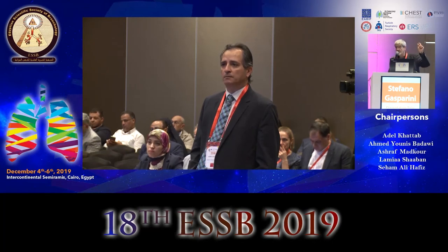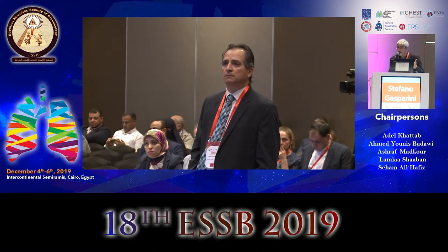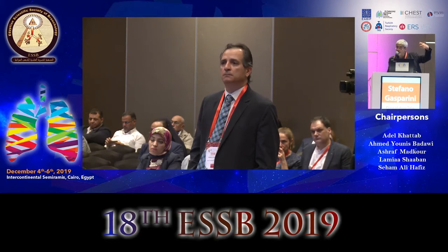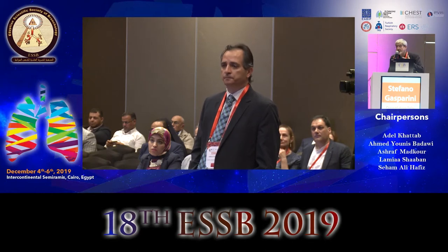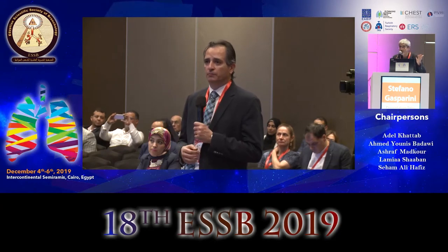I start with the syringe, with the vacuum syringe that is provided with the kit of the needle. If I get a lot of blood material, so the second passes I perform with capillarity. On the contrary, if I get few material, because the lymph node is fibrotic or it doesn't provide enough material, I apply manual aspiration with the syringe. So I increase the negativity. This is my habit, but I have no scientific evidence to support that this is true.